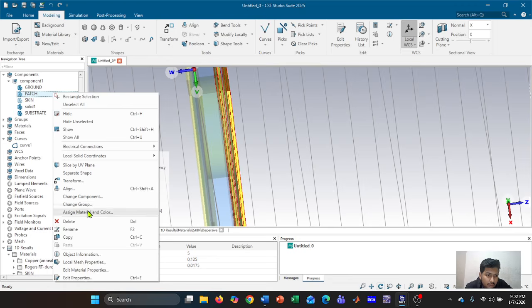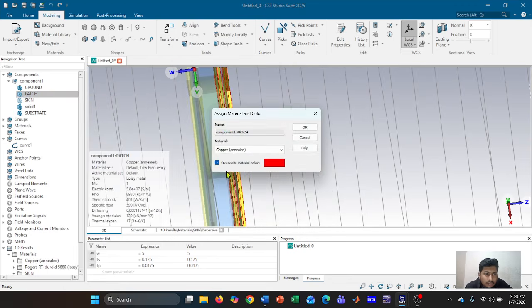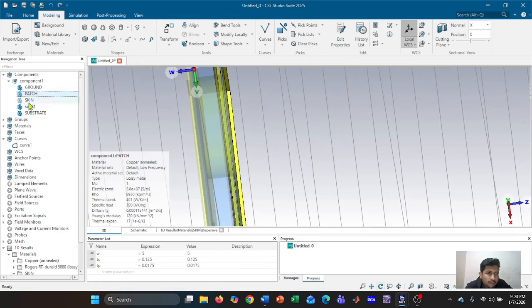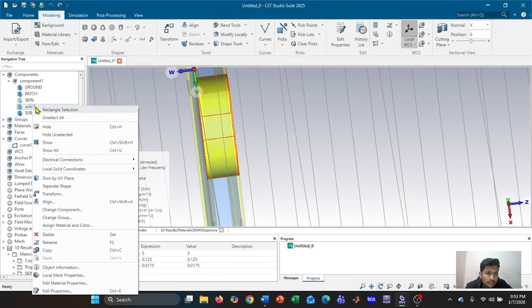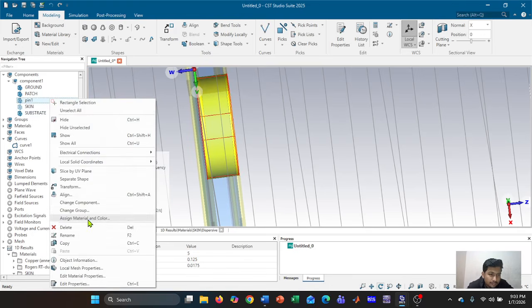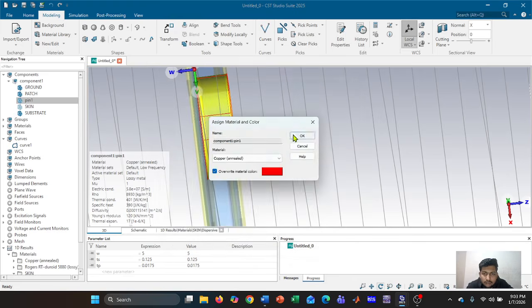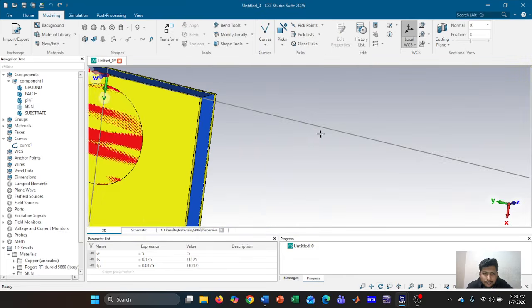Let's change the color of the patch. So this is the solid on this one. Let's rename it as pin 1, and change the color. So this is our shorting pin.